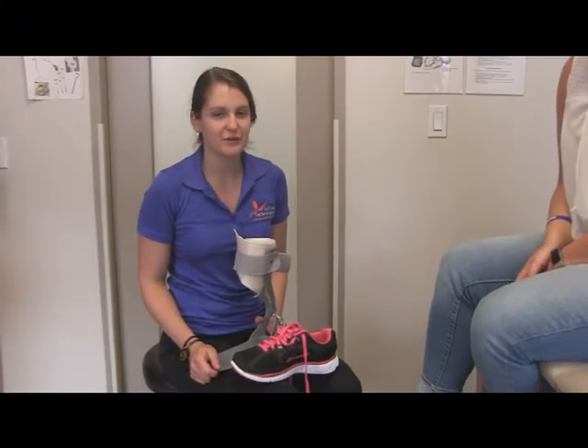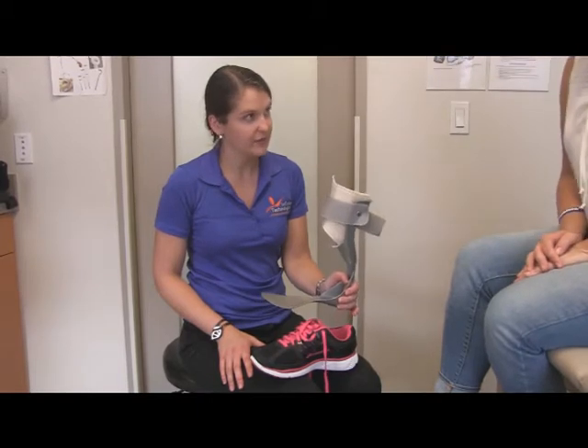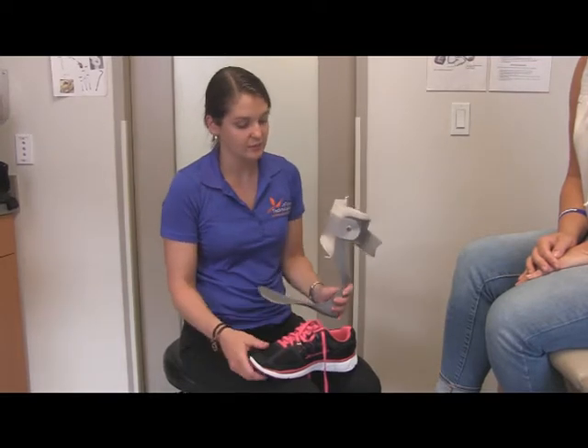Today we're going to be fitting our patient with a prefabricated or off-the-shelf AFO. This is done in one of two ways. The first way is placing the AFO in the shoe first and then having the patient place their foot in the shoe after. The second way is to put their foot on the brace first and then place the shoe on their foot with the brace afterwards.